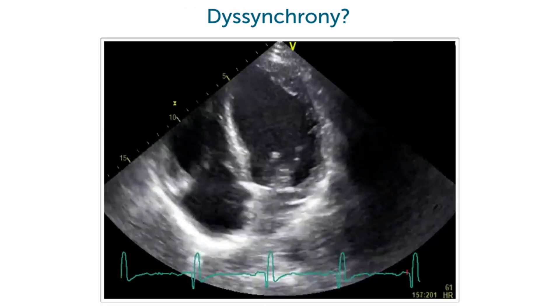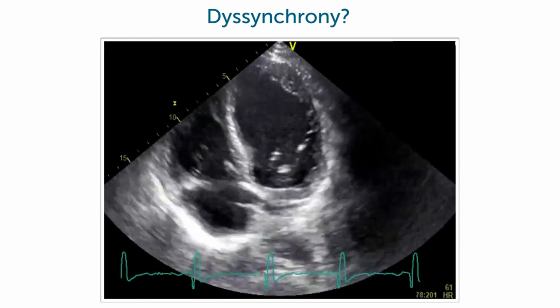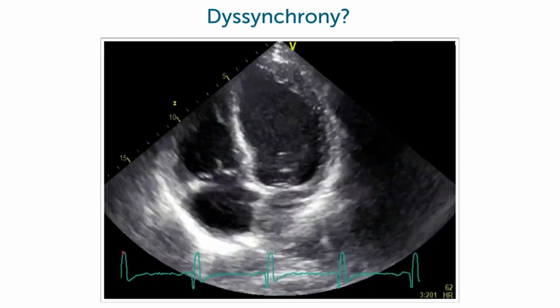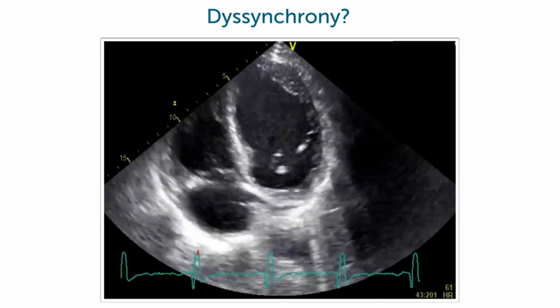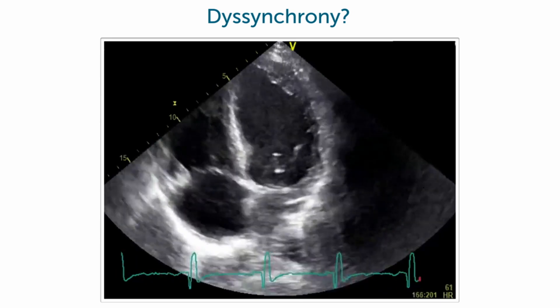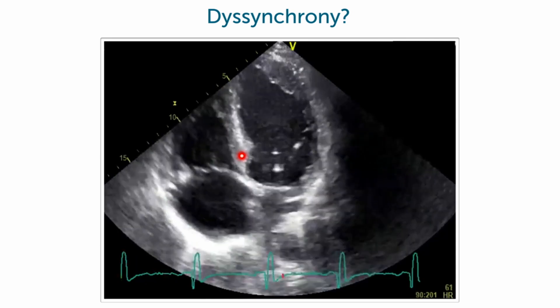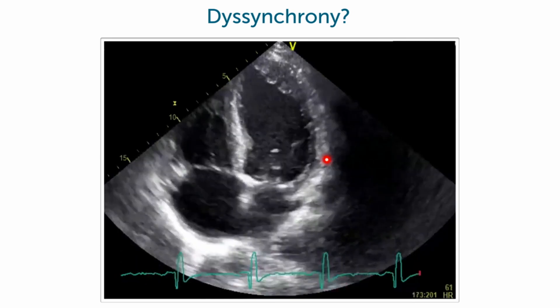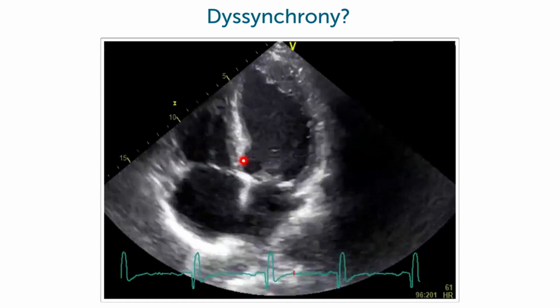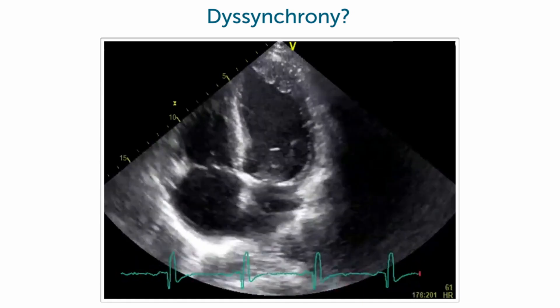What about this next example? I'll give you some time to take a look. This ventricle definitely looks different than the one before, but if you look at this level, you will note that the septum and the lateral wall contract at the same time. So this is a synchronous ventricle.